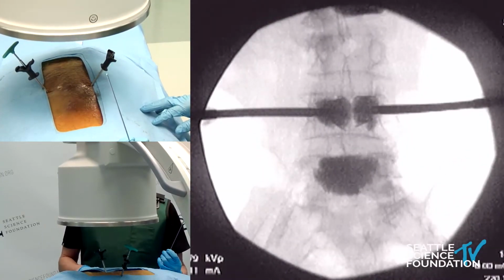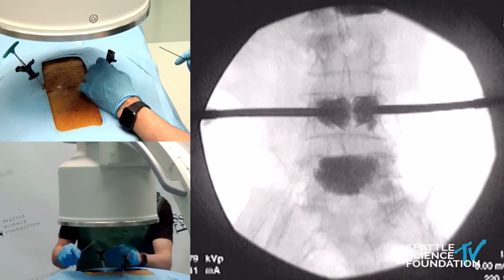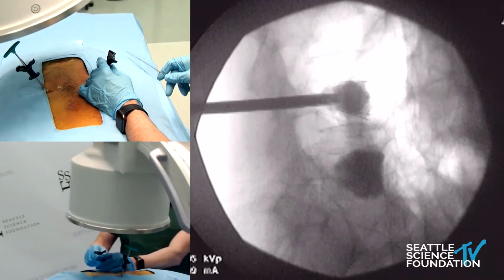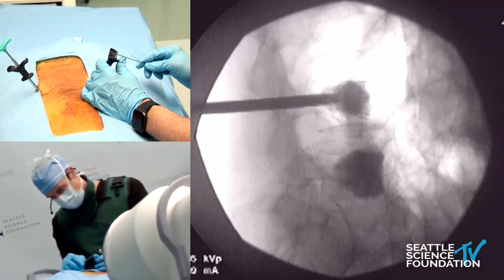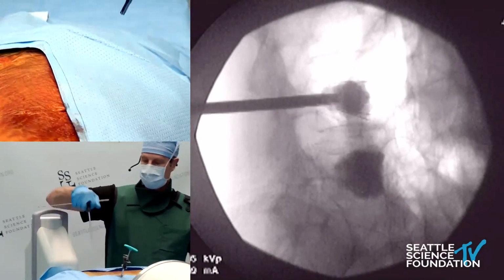Cement is very resistant to compression. Let's go back lateral. But it is not resistant to shear. So there's holes in here. You put the K-wire through, you turn this, twist it, pull it out.